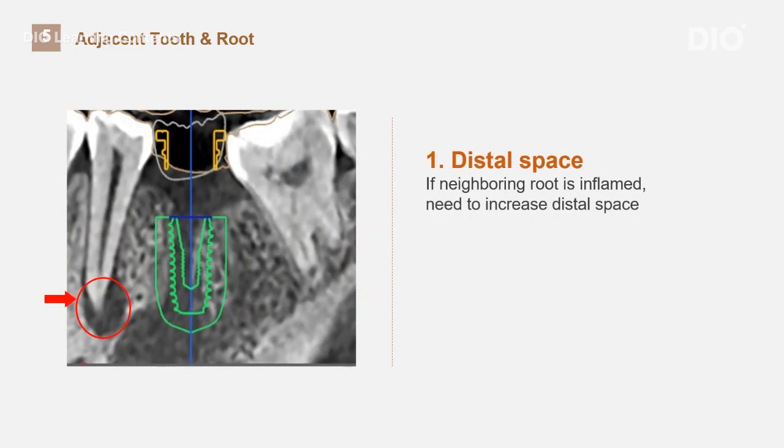If there is inflammation around the neighboring roots, widen the distance from that tooth a little more to prevent implant failure.